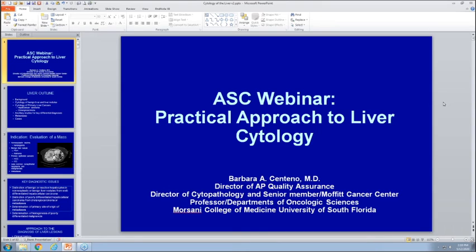So again, for the high-grade dysplastic nodule, we might be able to suggest it if there's clearly a nodule and we see a significant number of hepatocytes with small cell change, but we're missing some of the other features of hepatocellular carcinoma, such as widened trabeculae or the pseudoglandular patterns that I've mentioned. But I think it's going to be really difficult to give a definitive diagnosis on cytology alone. It's in these areas where the microhistology is complementary. We can certainly suggest it on cytology if it's in the appropriate clinical and imaging context, and we have some of the cytological features that I described. Does that help? It definitely helps.